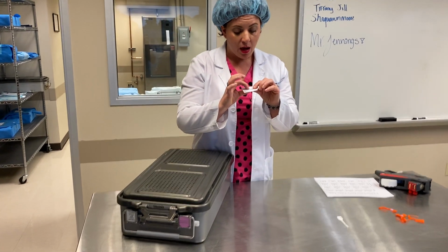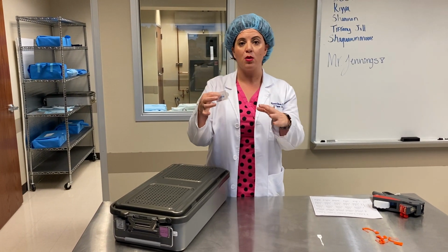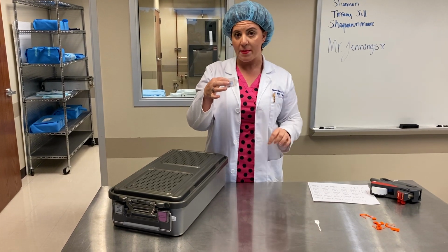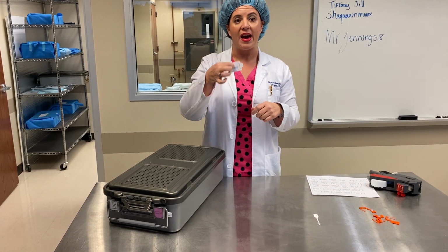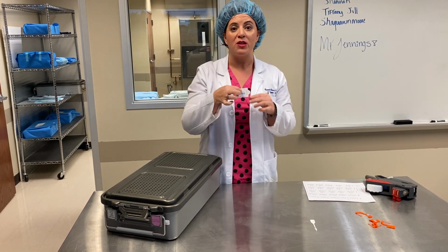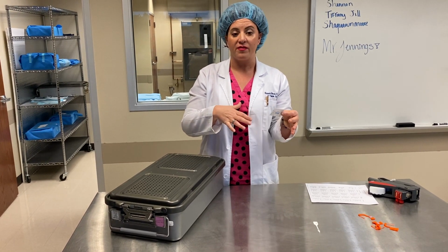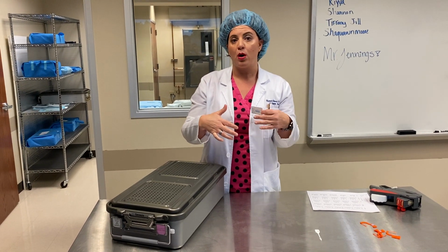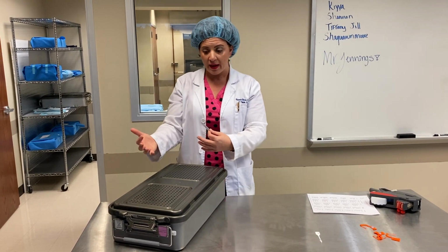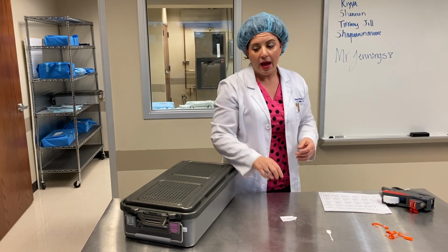And then it's also gonna allow them to look at the load number. When they run a load of instruments, they're gonna write down on a list every single piece of equipment that was sterilized in that sterilizer in that load on that day. They can pull those from the shelf and check those. They can do some spot checks to see if other items in the load are also wet or there's something going on with them.